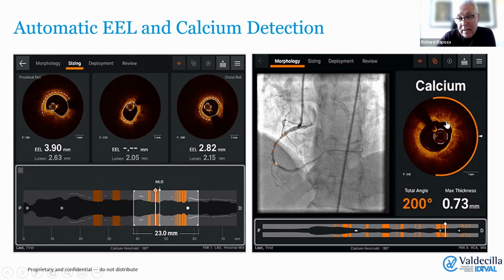And then the calcium itself can be detected, obviously, sometimes not the outer border, but at least the middle and inner borders are easily detected. Calcium has a very unique appearance, so it makes it easier to detect without having to get into more chemical compositions of any kind or anything like that. Again, this one is displayed anytime you see any portion of it as an arc. You can adjust in the deeper menus how much you want to show or not show, depending on the thicknesses and locations, so that you don't get distracted with minor portions of calcium.